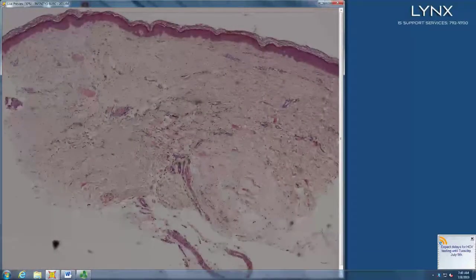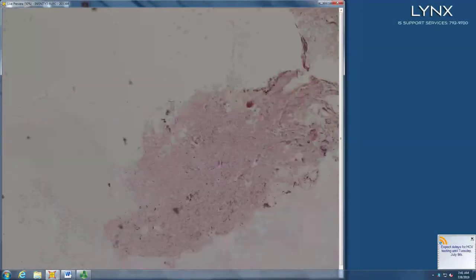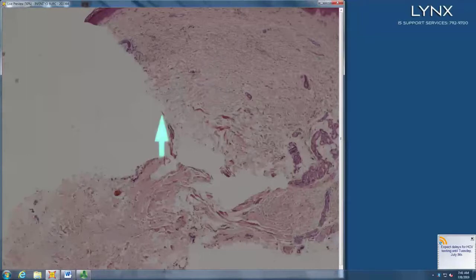So, fairly normal except for a little bit of an interstitial infiltrate. But when you look at the deeper biopsy, tell me the difference between this collagen up here and that collagen down there. Collagen balls. Yeah, or very, very hyalinized. So this is fairly normal, and then this is very thick hyalinized collagen with loss of space between the collagen.